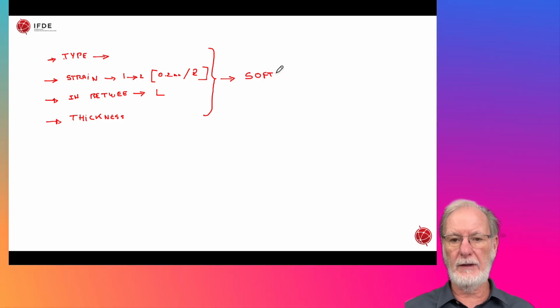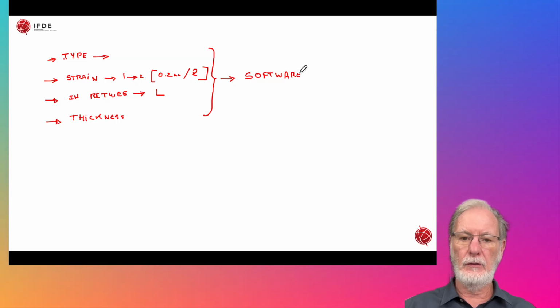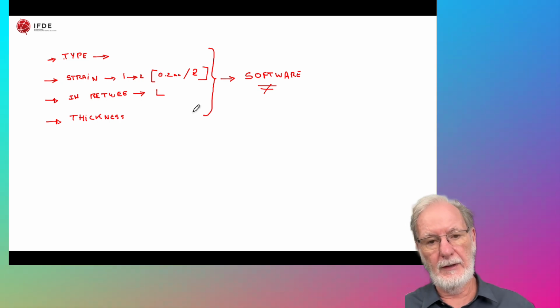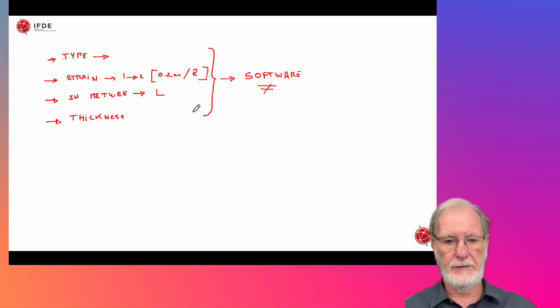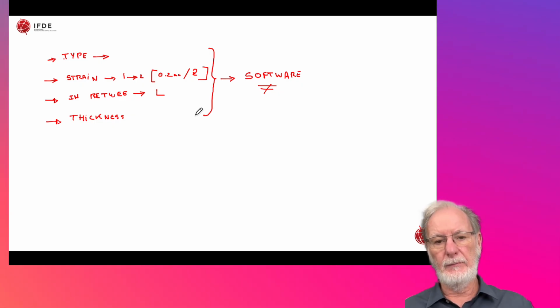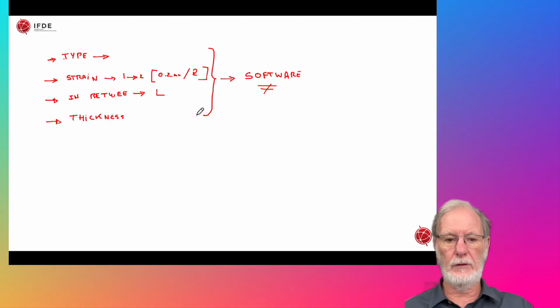So this is why we have so much variability in our aligner treatments, is at the moment the software and the aligner materials, and the fact that you may end up trying to apply forces that are not really optimized for the type of malocclusions you are correcting, is still getting us into sometimes unpredictable results.